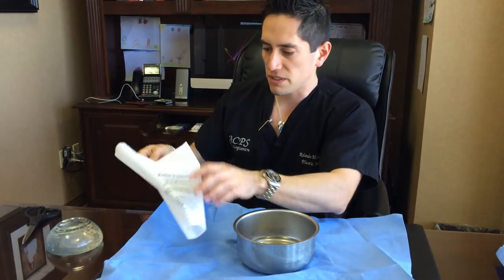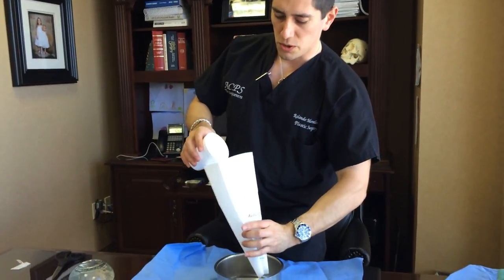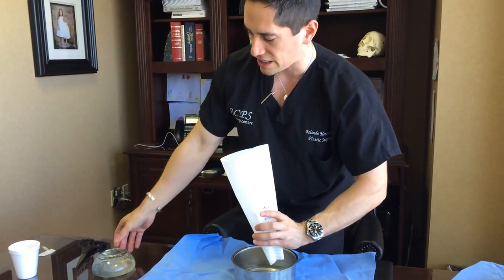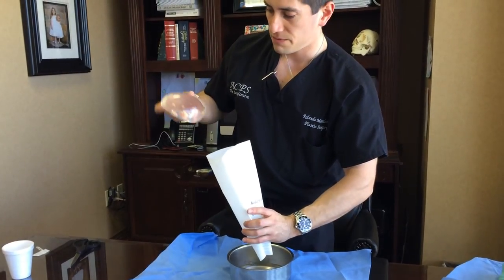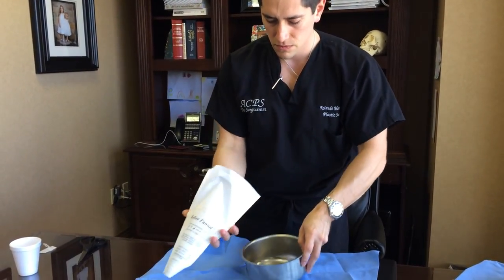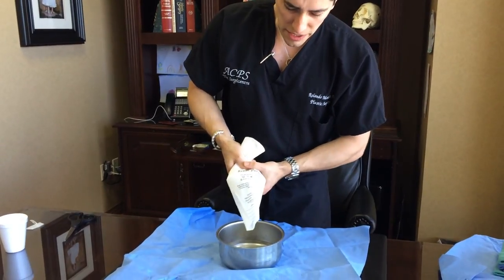To make this happen, I use sterile saline. I'm just going to use some water to recreate that. You lubricate the inside of it. The inside of this funnel has a very, very slick surface, and so it facilitates the sliding process. You take the implant, again sterilely, and put it within the funnel like this, and make sure it's all lubricated. Okay? And you can see the implant in there.